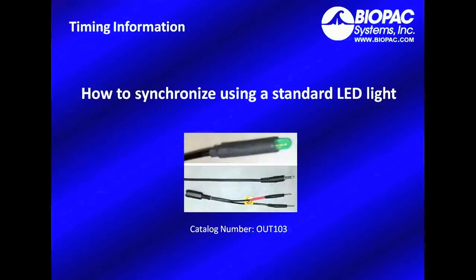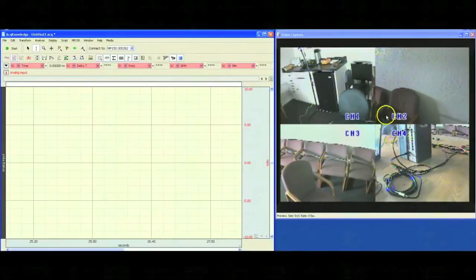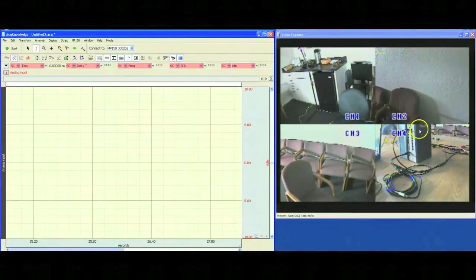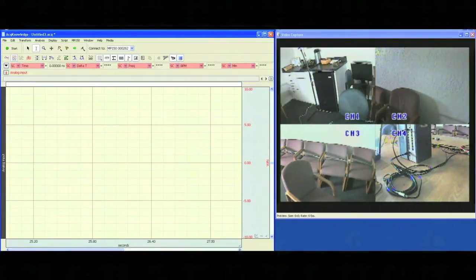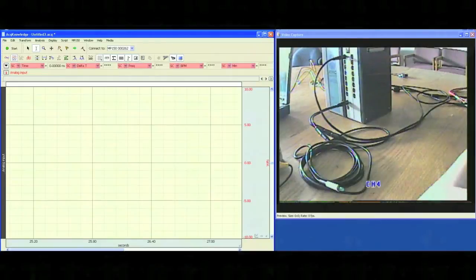Now that we've seen this system in action, let's take a look at some of the details such as how to synchronize using a standard LED light. For right now, we're going to take a look at camera 4, which has our MP150 system and an LED indicator light. To do this, I can just hit the camera 4 button on our multiplexer.